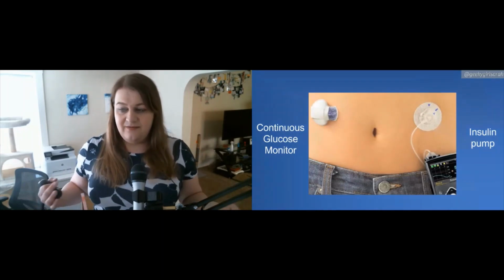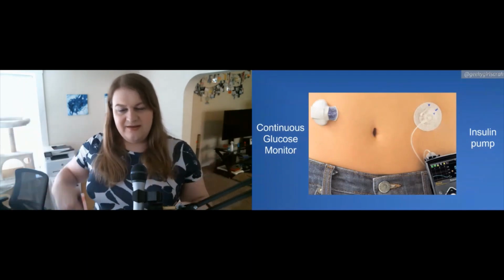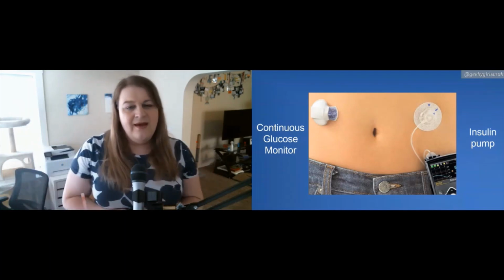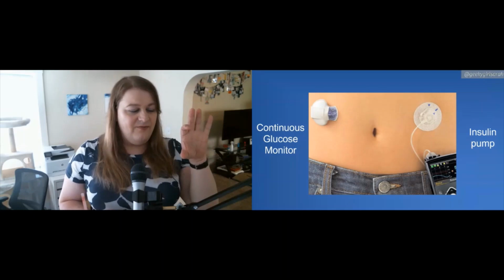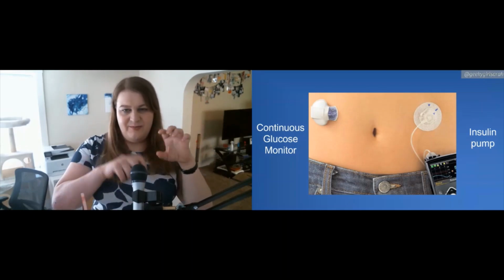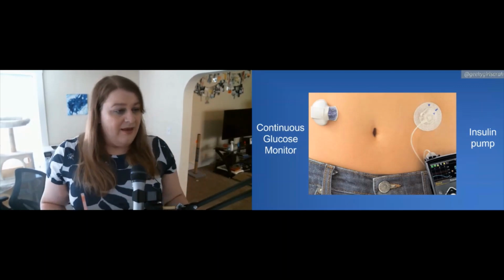The older ones look like a pager, and they have a long tube connected to somewhere. I've seen people do them on their back and on their stomachs, sometimes on their legs. The newer ones are kind of like pods. The insulin is all contained inside this little box, and this little box just goes on your arm. So it's kind of cool.